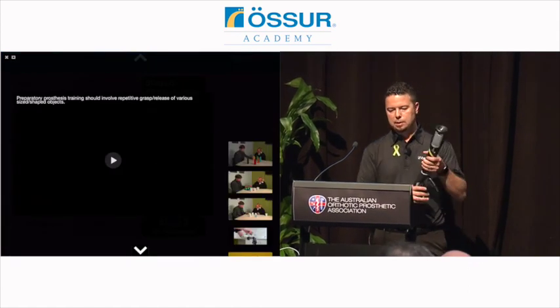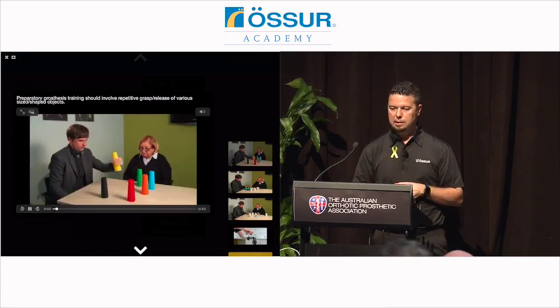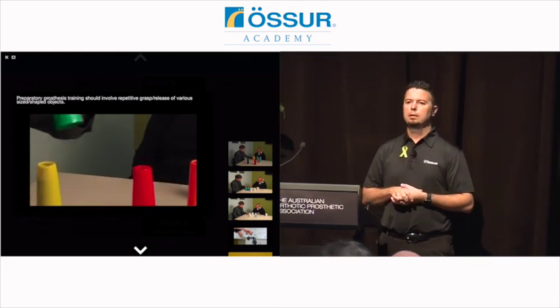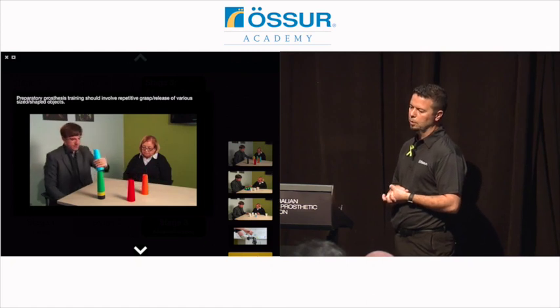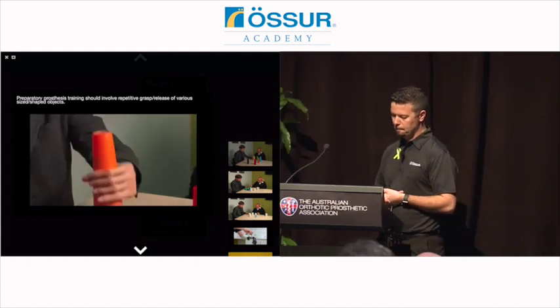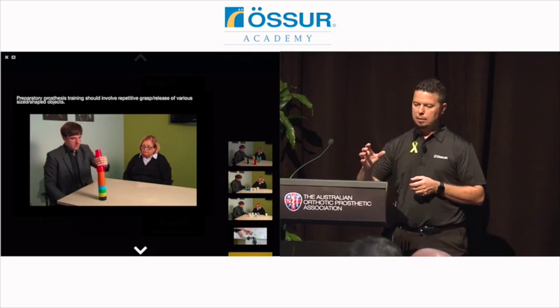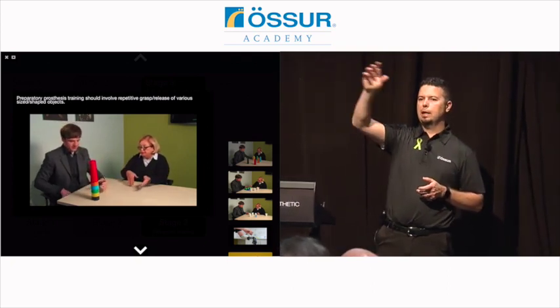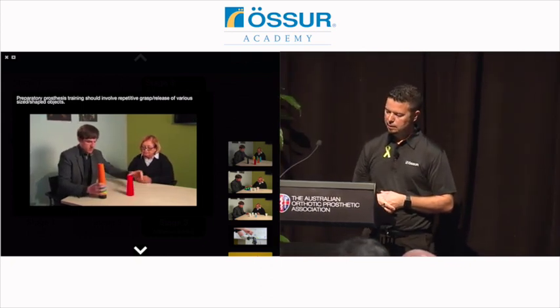And then at the bottom of each of these stages we have a bunch of videos and therapy ideas. So if you're working with a therapist, you could share a link to this to show them the different stage training approaches that you could do. And we're going to do these with Nathan here in real time. These cones are a great way to have them moving something in space and not dropping it, making sure they can relax their signals in all those different planes of motion, and then unstacking them as well.